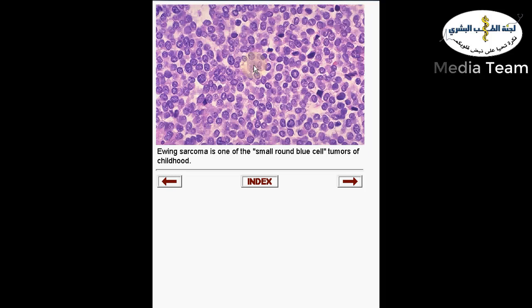The nuclei are perfectly rounded, monotonous. Every tumor cell looks like its neighbors. There's no pleomorphism in these tumors, not that much appreciated. And blue in color, mostly because of the high NC ratio. The nuclei, relatively to the cytoplasm, are large, that's why they appear blue in color.